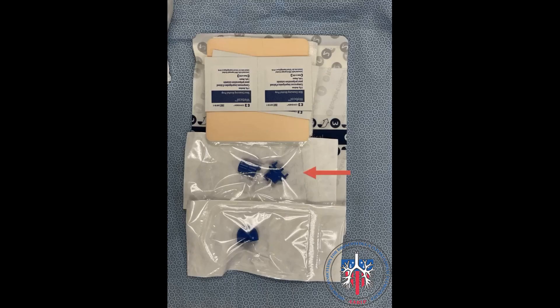The Plurorex Catheter to Rocket Drainage Line adapter is indicated by the red arrow. In the same packaging and next to the adapter is a blue cap that can be attached to the Plurorex Catheter. Below the adapter is a blue cap that can be attached to the Rocket Catheter.